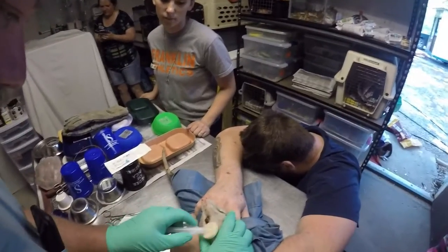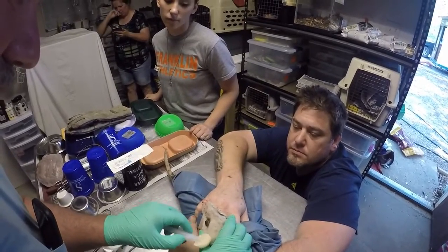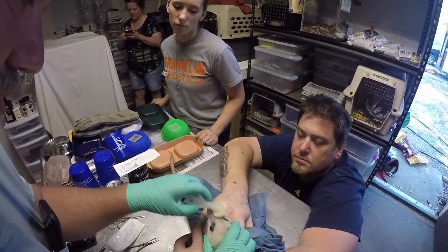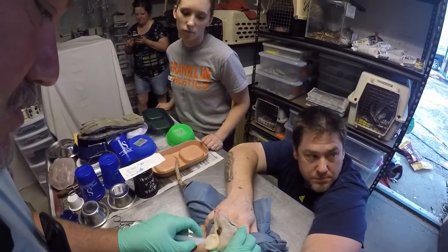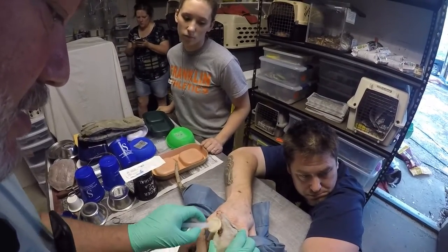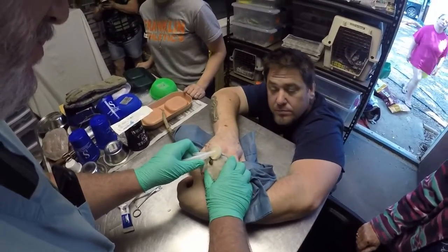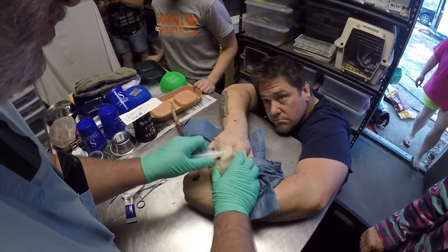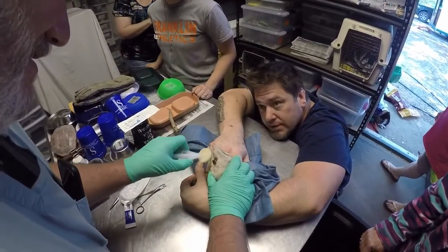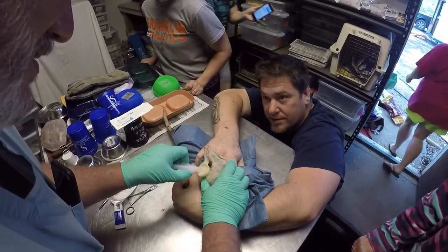I think it's about to come out as it is, isn't it? Are you going to take it out? I'm going to close this so Mother Nature can decide how much is going to stay and how much it's going to go. You're going to poke it back in and suture it shut? Mm-hmm. Mother Nature really is a much better doctor than I am. We need to get a sharpie and make an eye patch. A pirate possum — just get some eyeliner. The Mississippi Pirate possum.